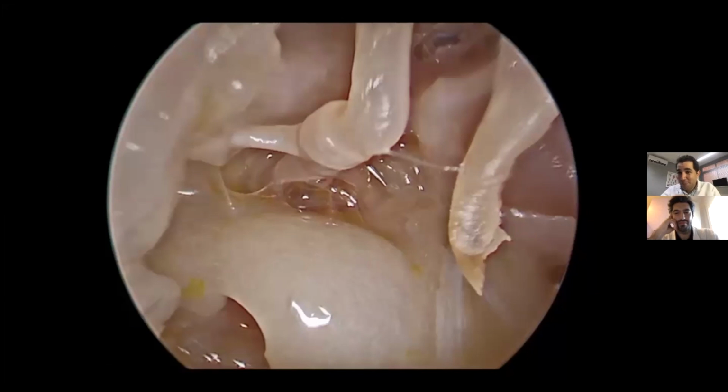And with the endoscope, the advantage, and that's why I always like to stress that the endoscope is made for the middle ear and the mastoid is made for the microscope. The endoscope is very nice because, without destroying a lot of tissue or a lot of bone, transcanal it can give you this, so that you can work, understand, and see the disease. Once you do this, you can remove the disease, improving your surgical results.